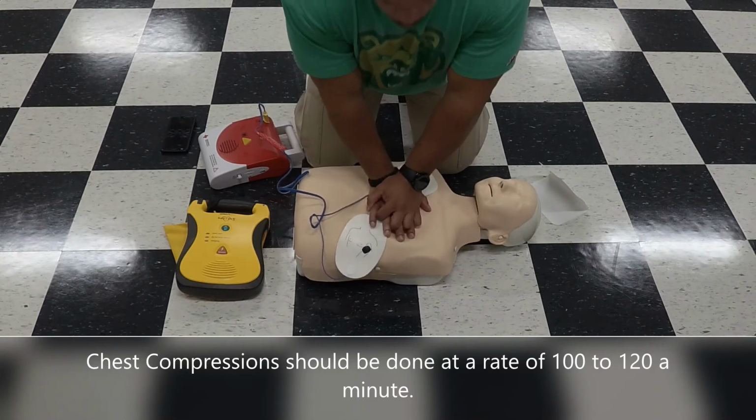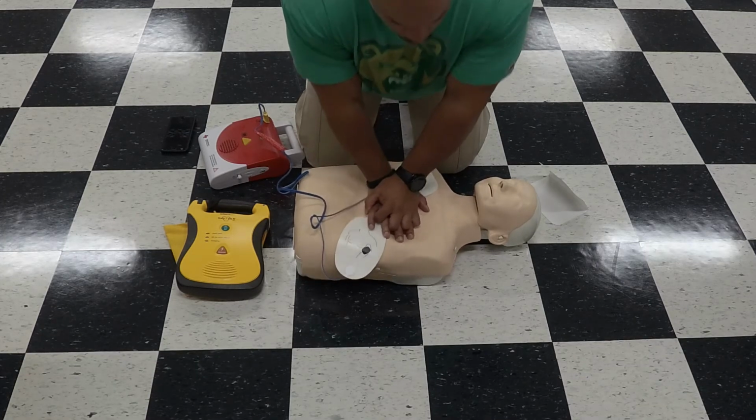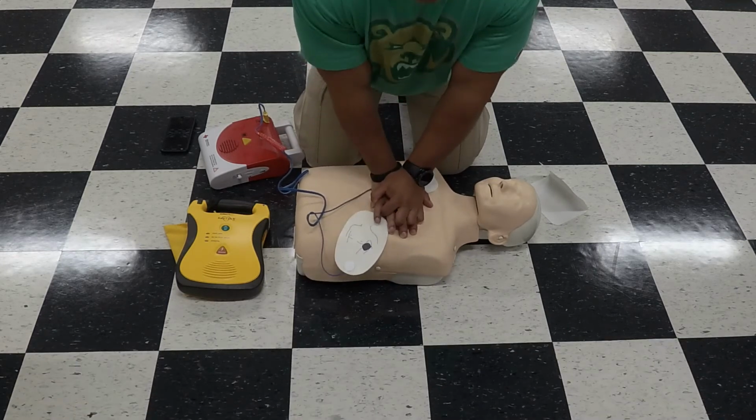1 minute and 30 seconds of CPR remain. And that's 2 compressions a second, 120 compressions in a minute.